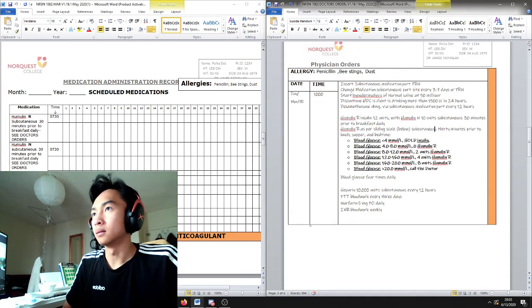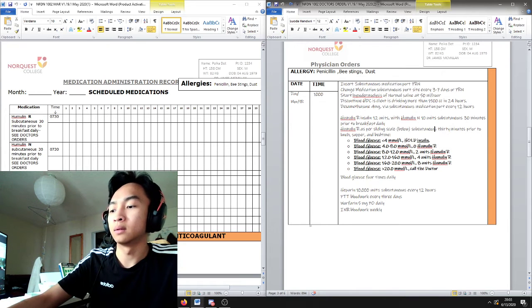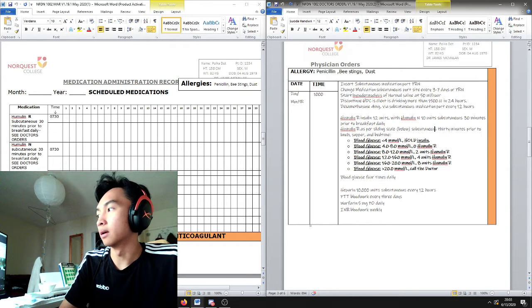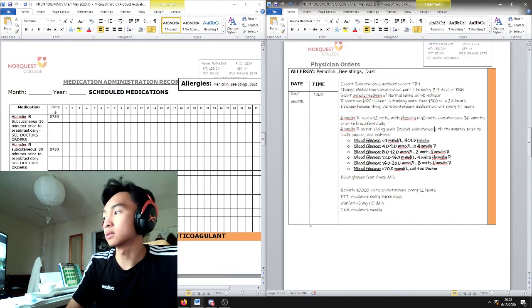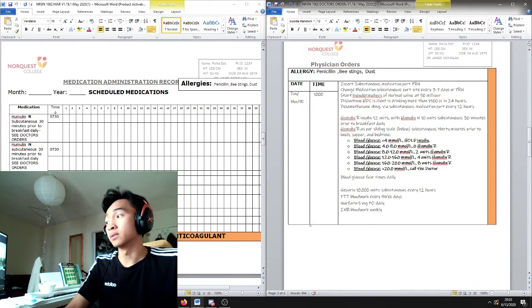And as I'm putting everything away, storing the medication and the insulin back in the med cart, I am doing my last check, my last 5 rights. The right name, Mr. Sweet, medication, Humulin N and R. Dose would be Humulin R 12 units, Humulin N 10 units. Route would be subcutaneous. Time would be 30 minutes prior to breakfast.